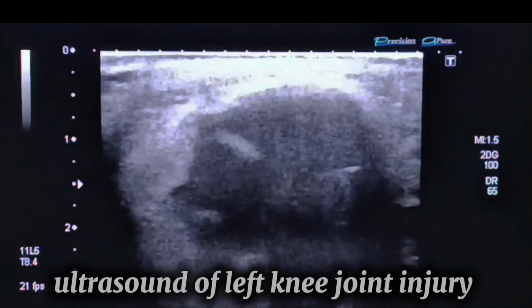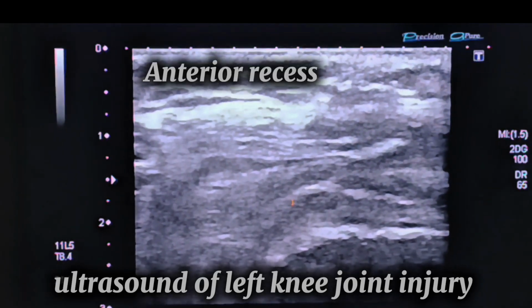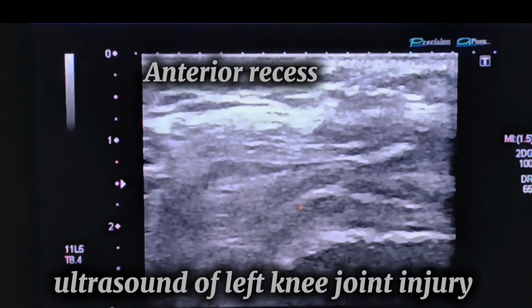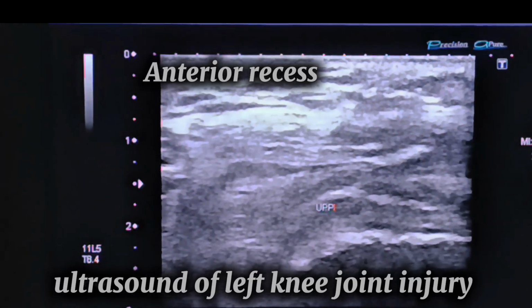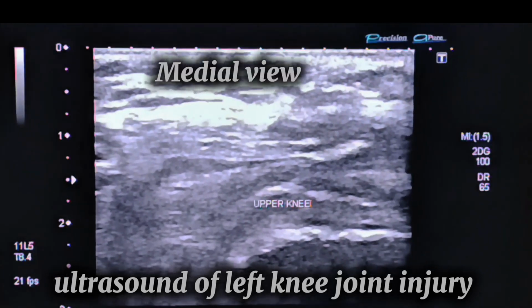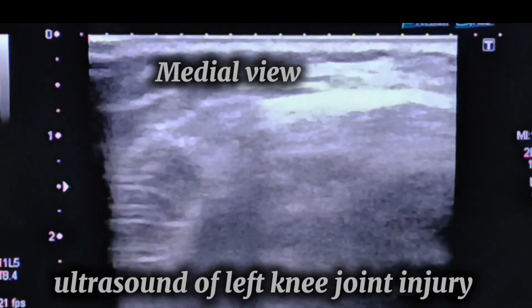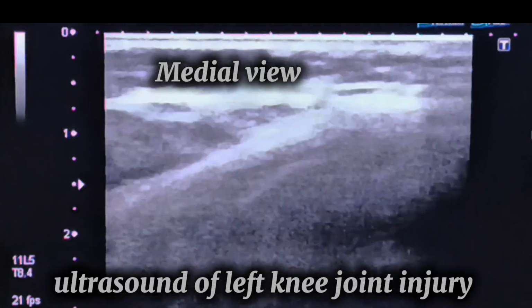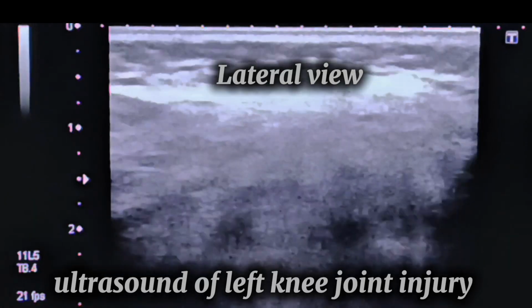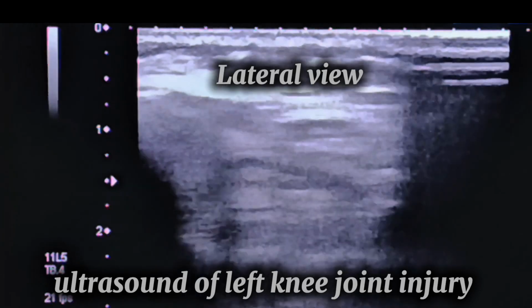The knee joint is typically evaluated in multiple views or angles. The anterior view shows quadriceps tendon, suprapatellar recess, patella, and joint effusion. The medial view is used to assess the medial collateral ligament, the medial meniscus, the medial femoral condyle, and the tibial plateau. In the lateral view, we assess the lateral collateral ligament, the lateral meniscus, and iliotibial band.